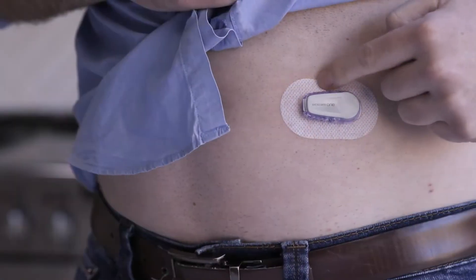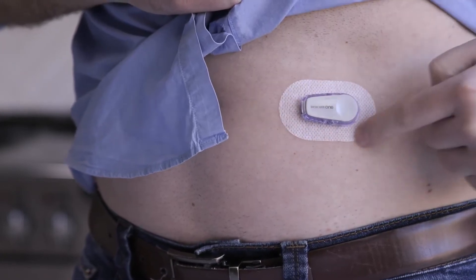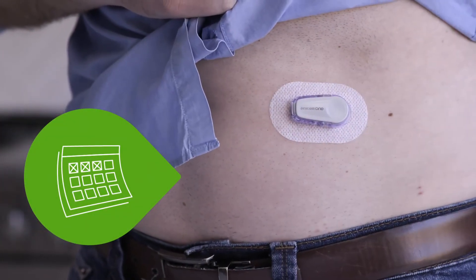Click the transmitter firmly into place. Rub around the patch three times. The transmitter is now attached. You'll reuse this same transmitter for three months.